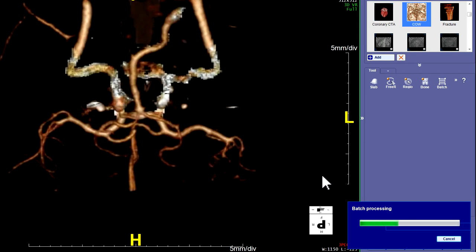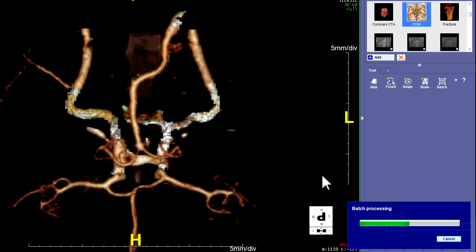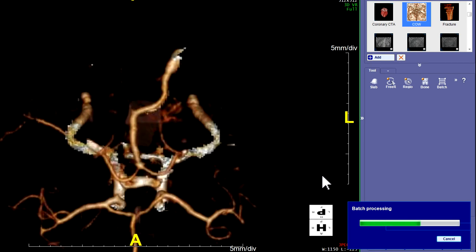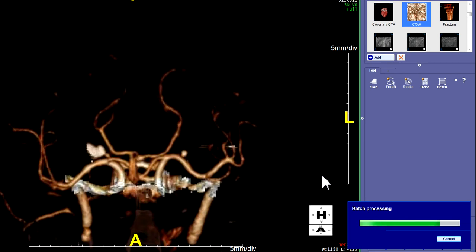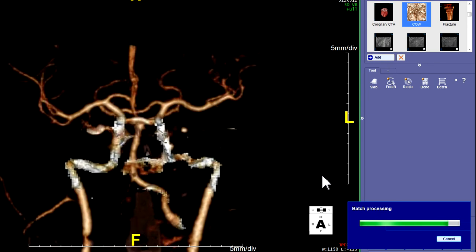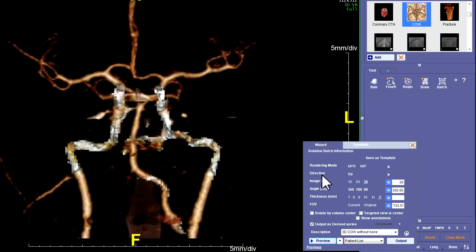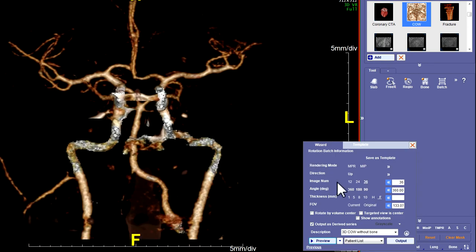Maybe drag that back a little bit to make it fit a little bit better, adjust it. Make sure that everything looks good on your preview, and then hit output, which will send it to the patient list.